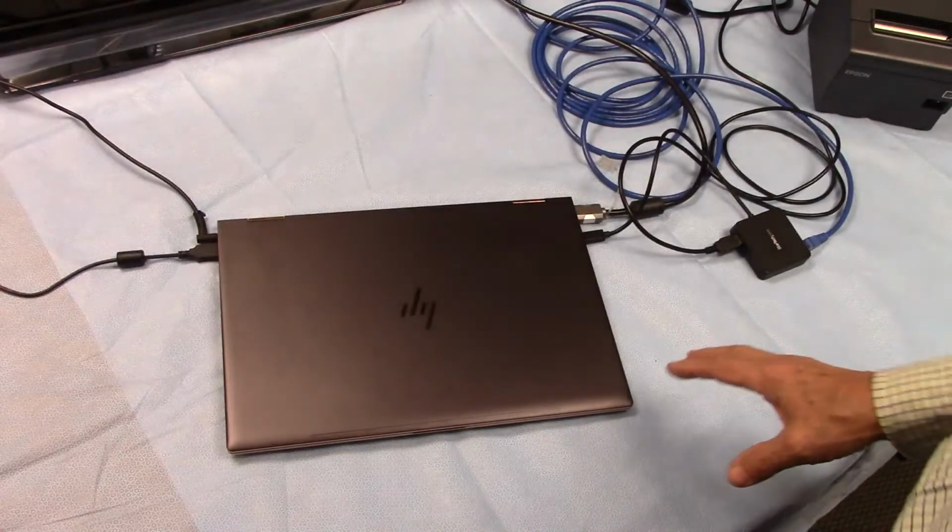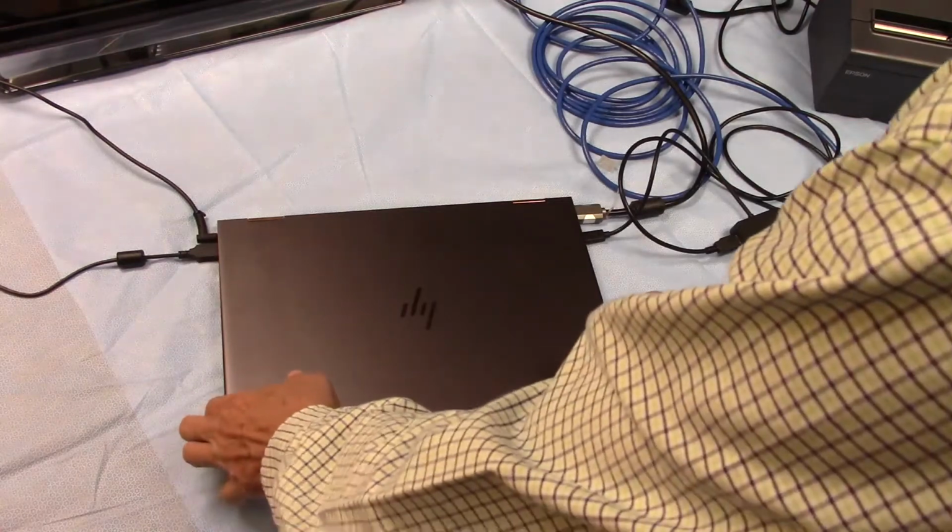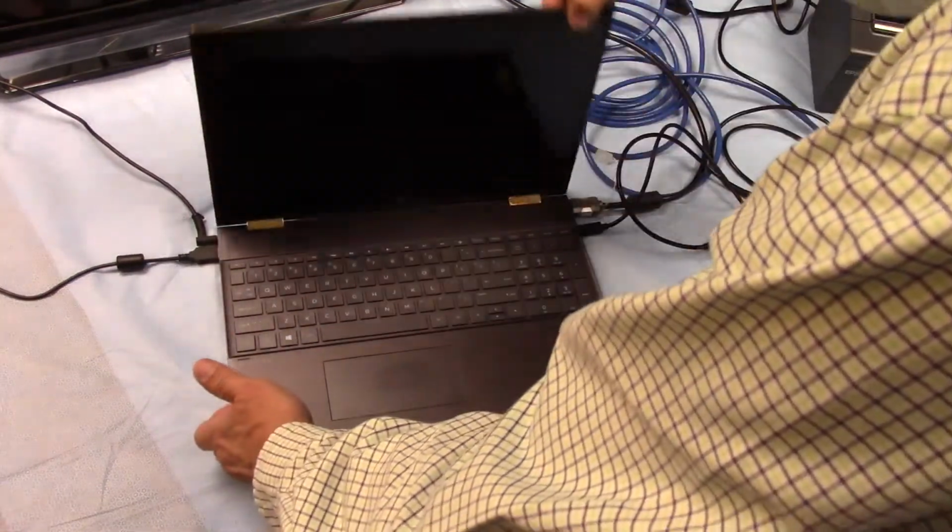The next step is to turn the computer on. We want to make sure that all of these peripherals are powered up. Computer gets powered up last.